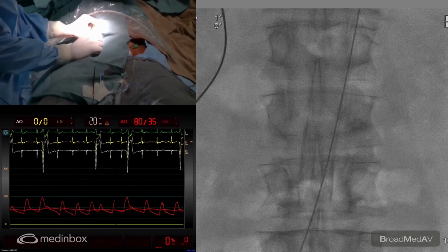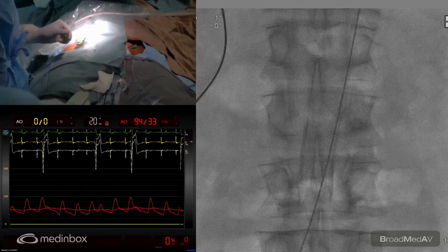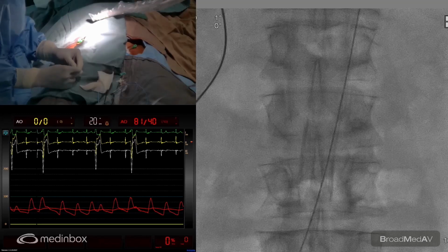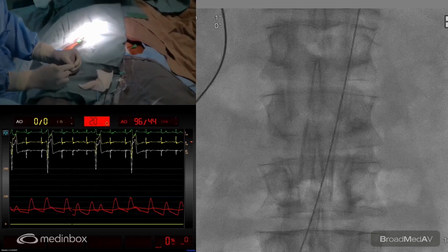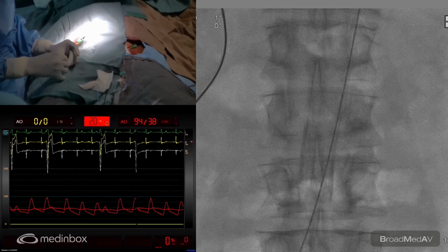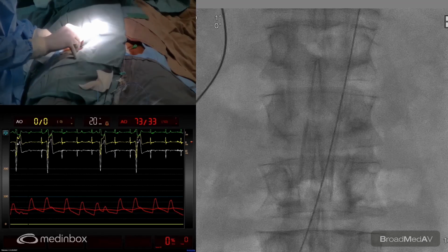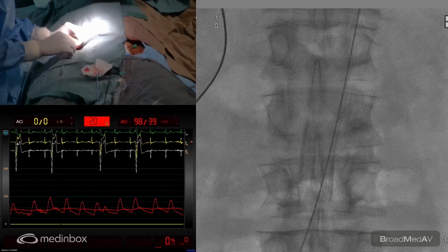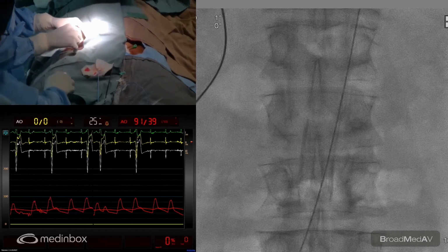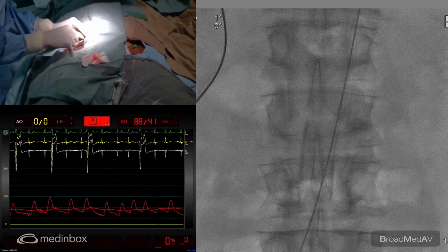Okay, so the strategy we use is, Nanda, are we going to use one proglide and one, or would I think the size of the femorals are good, so I think we will straight away go for the two proglides. So we're going to put two proglides. As you know that with two proglides, sometimes you get an indenting of the access site, but with large accesses, we are not uncomfortable using two proglides.